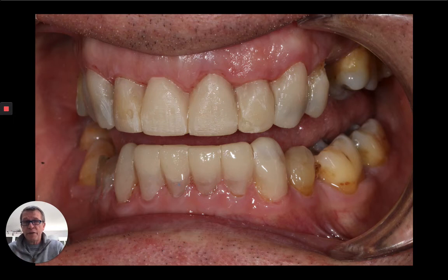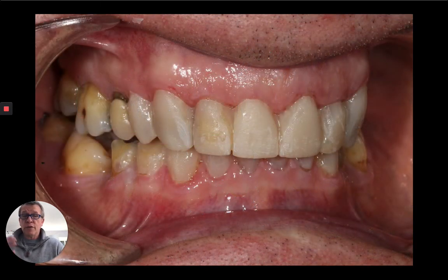Now I have the lower incisal edge, I have the upper incisal edge, I have the patient's approval. I'm just going to close them together, stable condylar position, anterior teeth together, and I rescan them at that vertical dimension, and then we could finish the rest of the wax up off. And it makes these cases go so well, you know. So there's all sorts of cool things that we've gotten as well now.